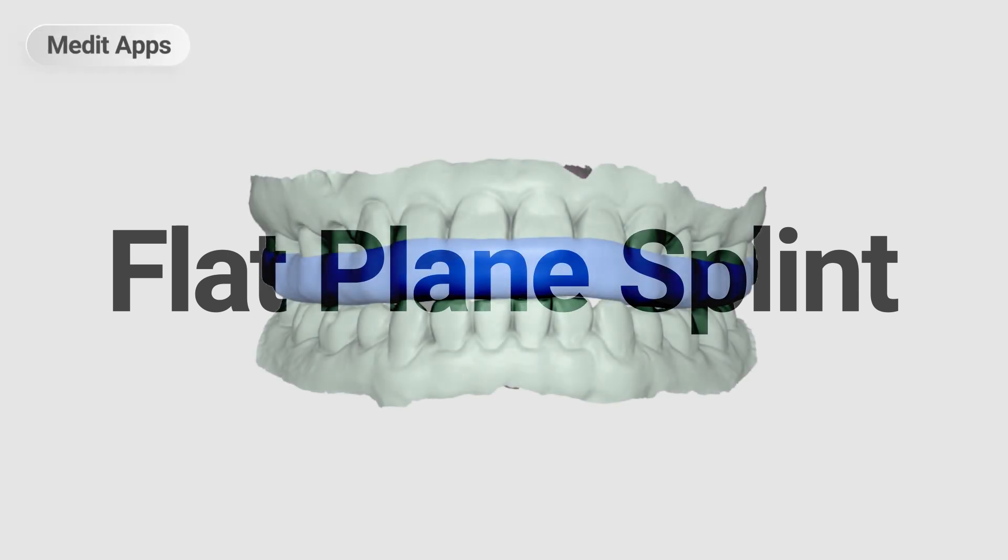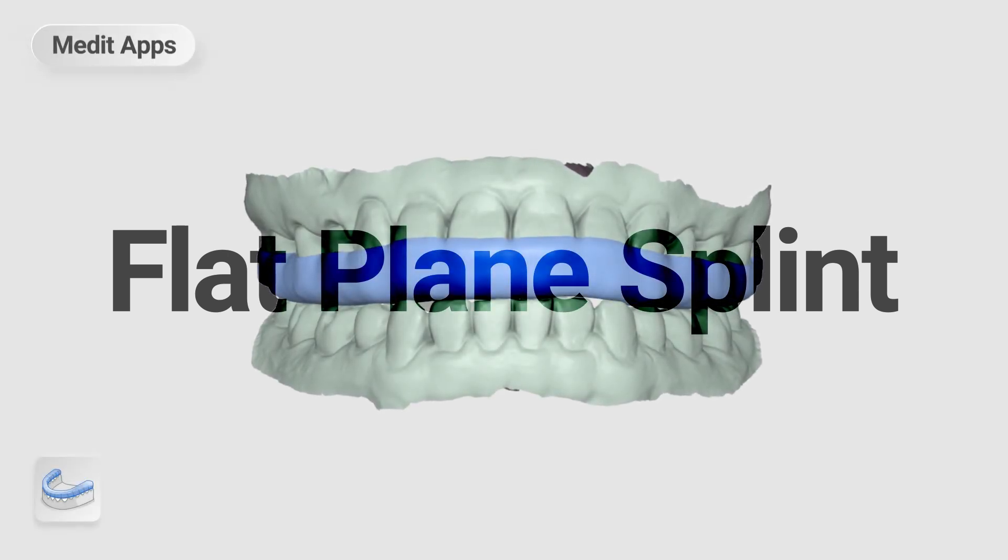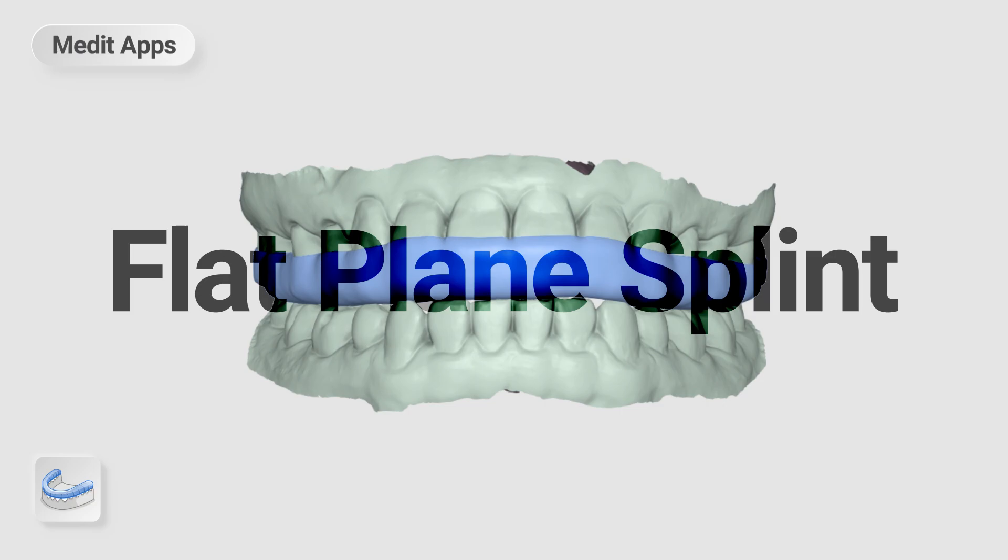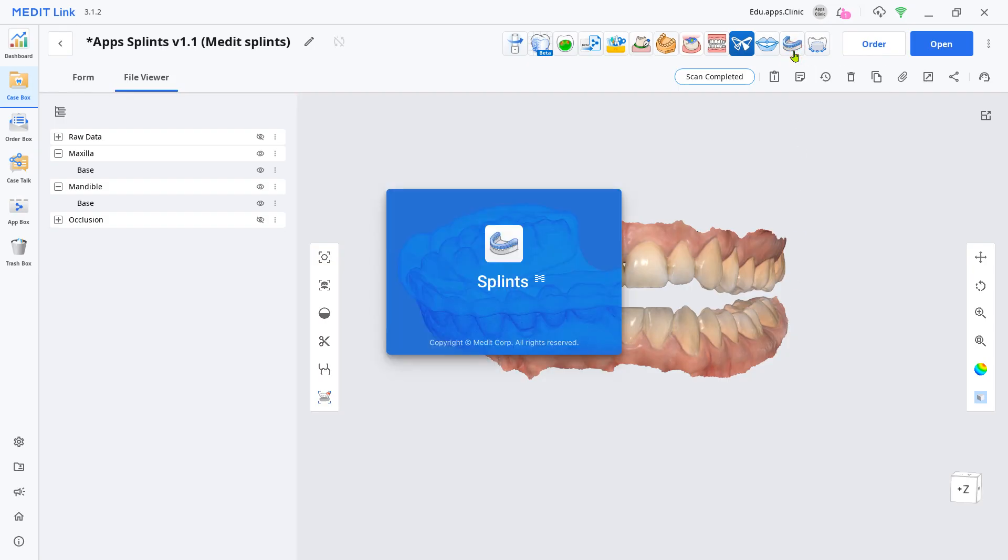This is a quick guide on how to design a flat plane splint with the Splints app. Load your scan file from the Splints app.